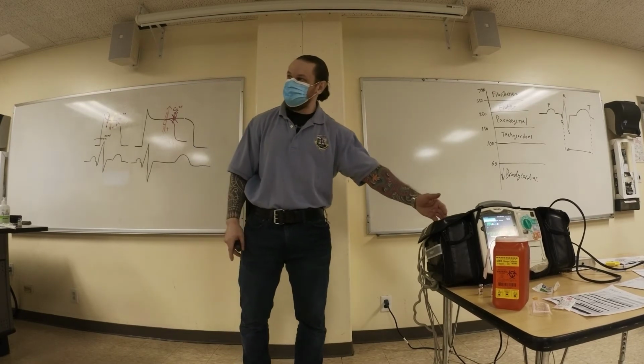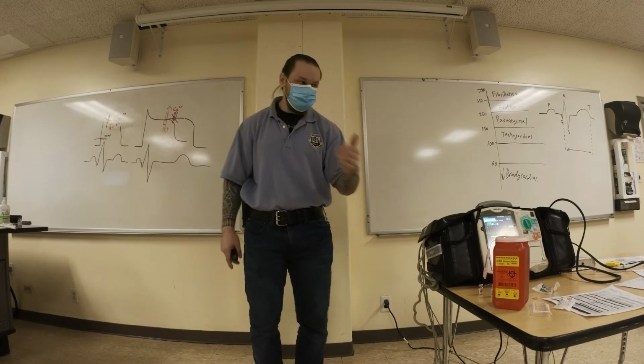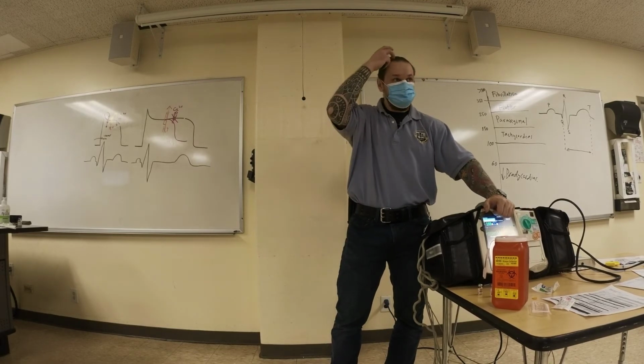Unstable, you're going to go to your regular synchronization, right? If you cannot synchronize, it doesn't give you the shock. Do not just stay there pressing this button, wondering how come it doesn't give it. Just give unsynchronized. Right? Any questions?